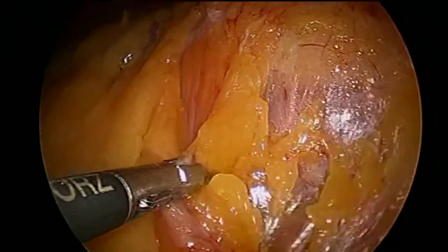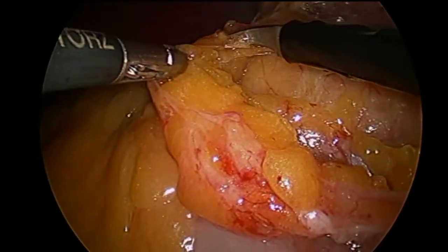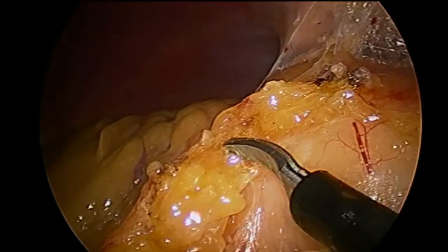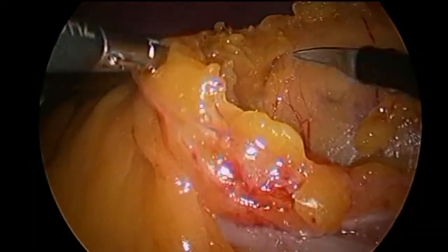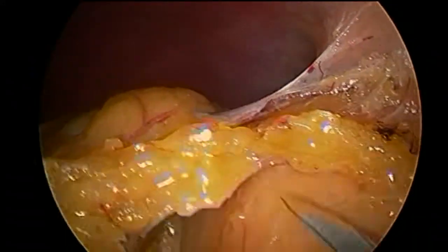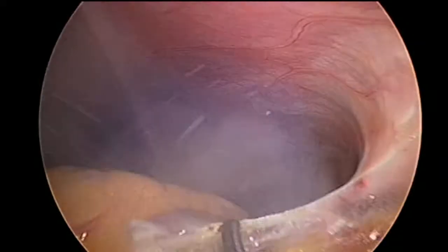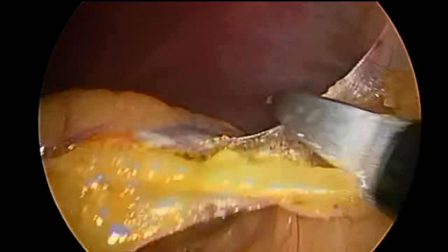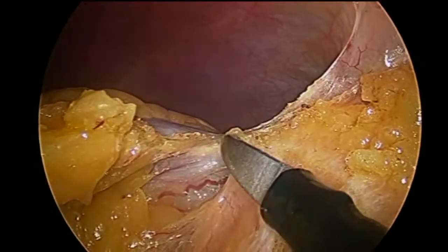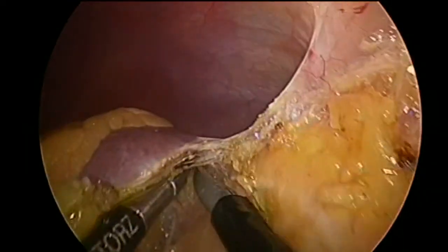In this section we're mobilizing the spleen, and again it's a very important step in the left nephrectomy. I generally perform this fairly early in the piece to try and drop the spleen and the pancreas around. It's important that you have a nice retraction beyond the spleen. You have to push the retractor beyond the spleen so that you can push it away properly without sticking something into the side of the spleen to make it bleed. That will allow optimal mobilization. The spleen needs to be mobilized all the way down so that you actually cut the peritoneal attachments on the lateral side wall that are holding the spleen in place so that it actually falls away completely.